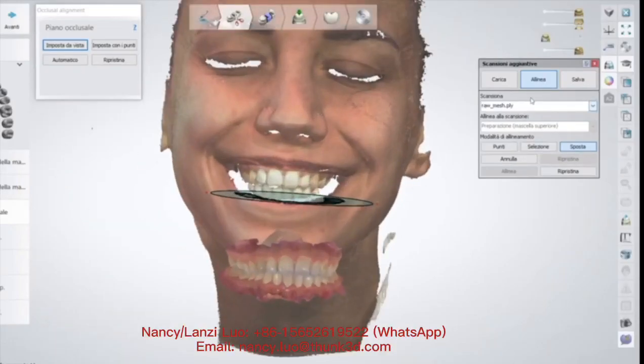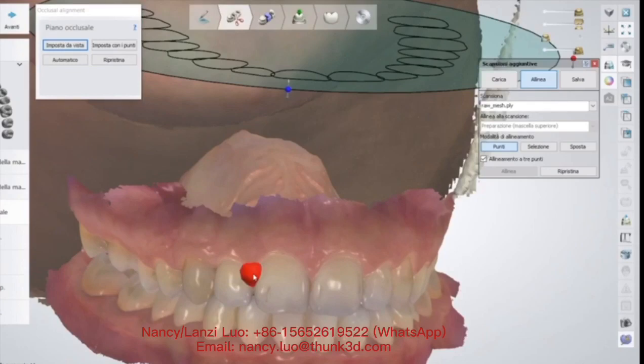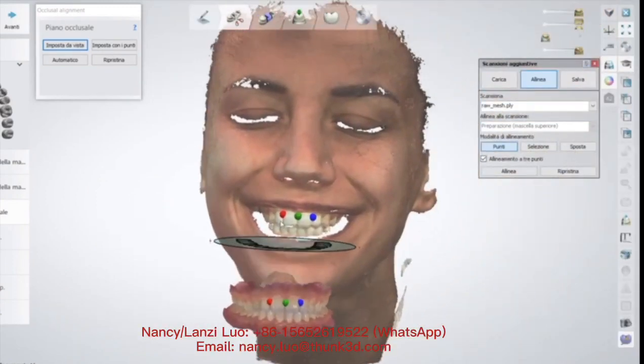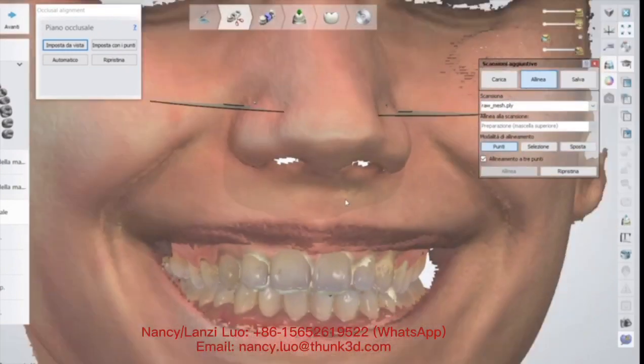We can use exocad in lab, or in this case we are using Tree Shape dental system. What I do is match the facial scan with the intraoral scan using a three-point alignment, then we align in order to obtain a unique file that we can also export from the dental system in DCM format.